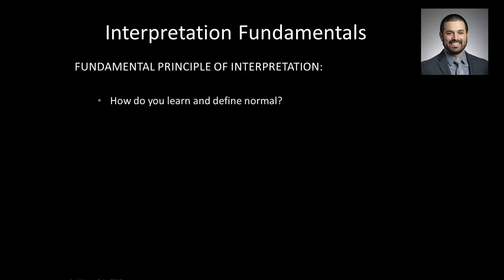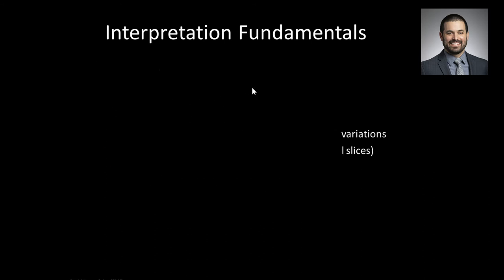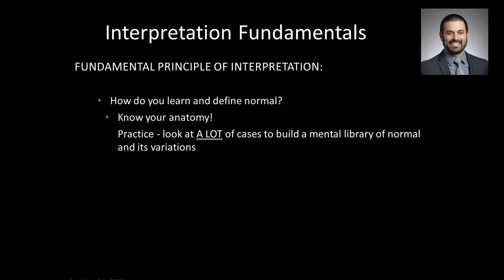So extending this discussion further, how do you start to learn and define normal? Because again, it all comes back to this. You must be able to recognize what is normal from abnormal. Well, you have to know your anatomy. And how you know your anatomy is, number one, lean on what you learned in dental school, which for myself and many others may be years and years and years ago.